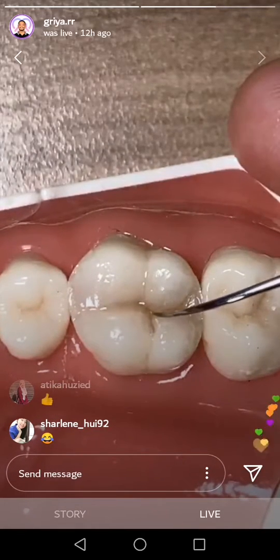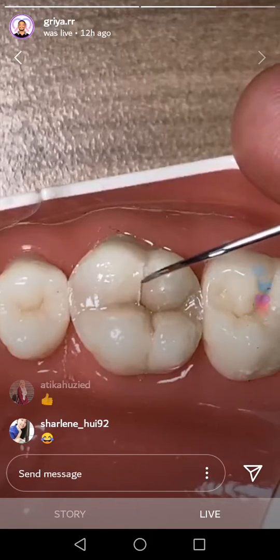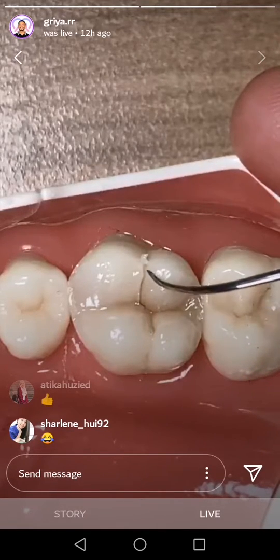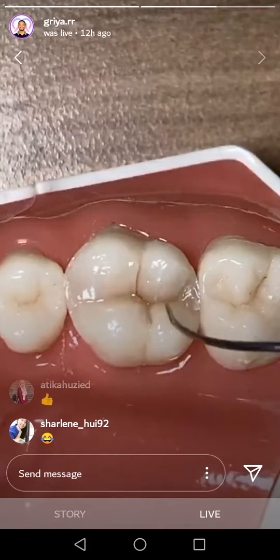Now let's make a line again. Okay, anak gua nangis lagi tuh.